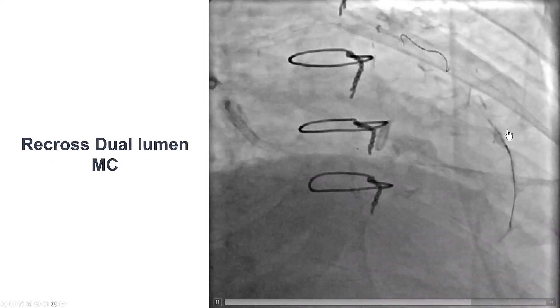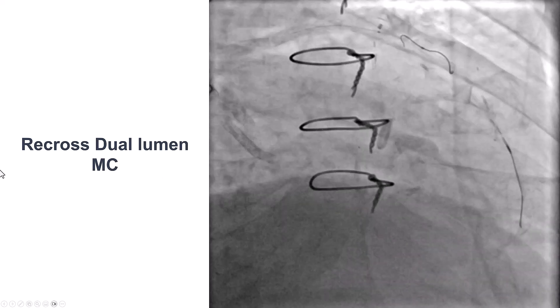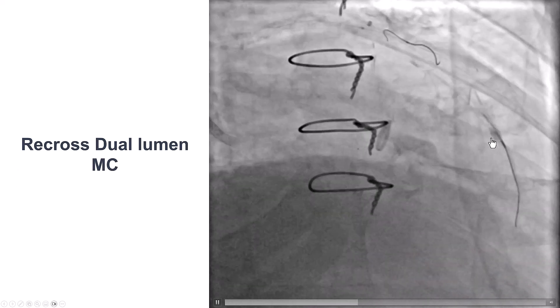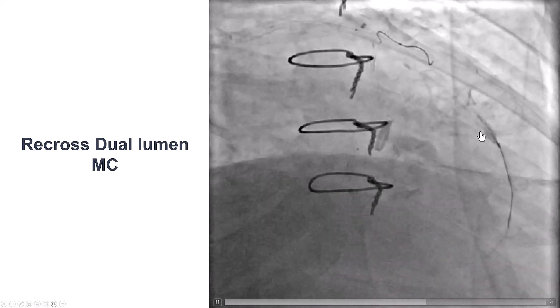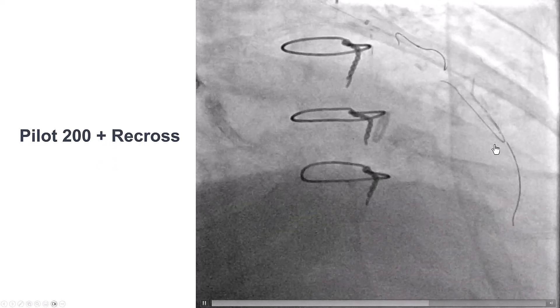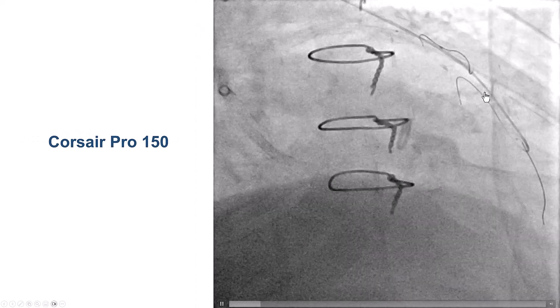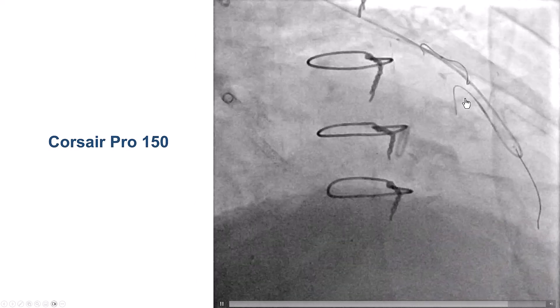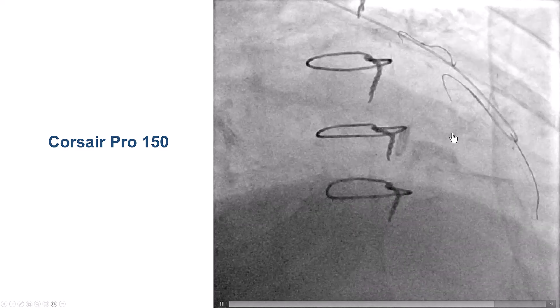We then switched to a dual lumen catheter, which can also provide good support. This is a Recross dual lumen that has two over-the-wire lumens going all the way to the distal cap. We injected through the more proximal lumen and clarified where the LAD was and where the anastomosis was. We then used a Pilot 200 guide wire and were able to advance it retrograde along the course of the LAD. We removed the Recross and advanced a Corsair, which very nicely took the tight 180-degree bend going retrograde into the LAD.